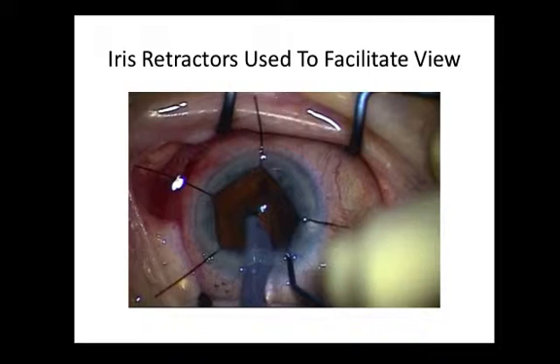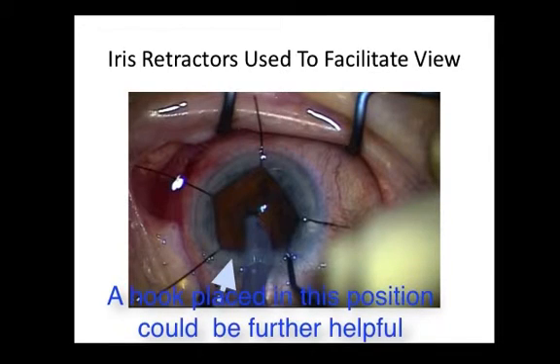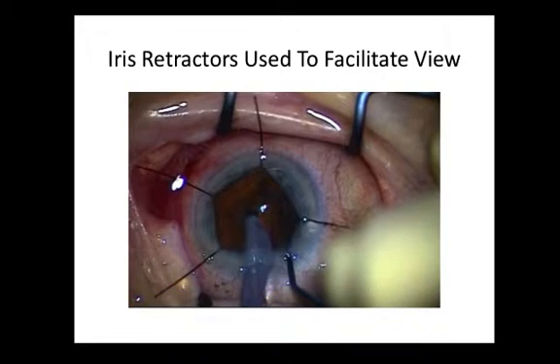Iris retractors are valuable instruments to facilitate operative views, as in this case. Where possible, the iris should be retracted well away from the moving phaco probe so that the probe does not rub and induce iris trauma. This can often best be achieved by placing at least one retractor as close to the section site as possible, and if possible, posterior to the section site to retract the iris away from the more anteriorly placed phaco probe.